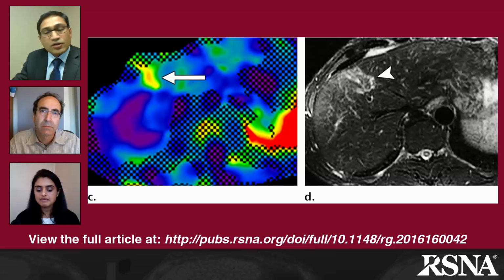And you can see that on the correlate, the T2 weighted image in figure D, which shows hyperintensity in that region and dilated ducts. Now, these features were initially identified before, and everybody knew these things are happening in primary sclerosing cholangitis. But we now have a correlate. Again, it corresponds exactly to the area of stiffness, the area of signal intensity.